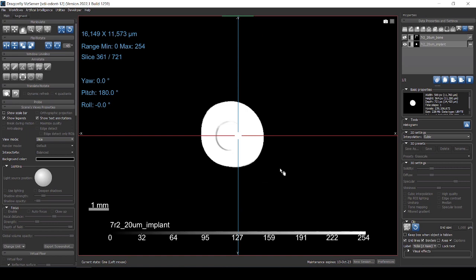I have loaded already the implant and the bone. I've done a segmentation before. The segmentation was performed using deep learning, so I had to train a network to segment properly the bone from the implant, and that can be a bit tricky if you try to use normal segmentation just based on thresholding. So I encourage you to try and have a look at the videos that have been put out on YouTube from Dragonfly. They will be teaching you how to use deep learning or machine learning to segment your samples.